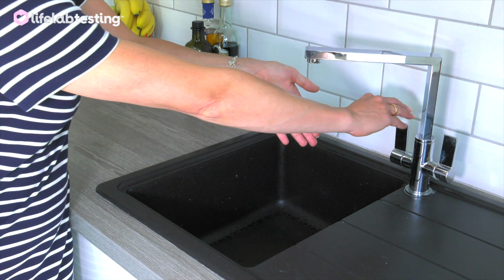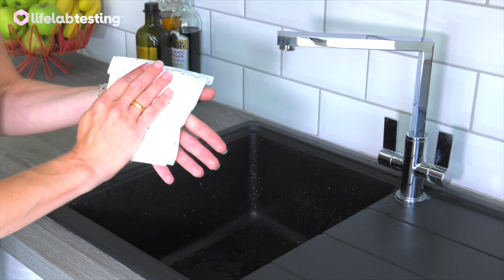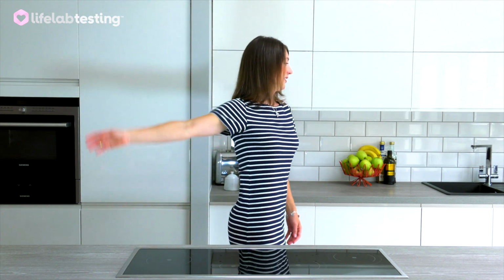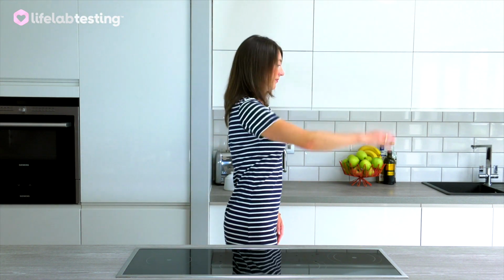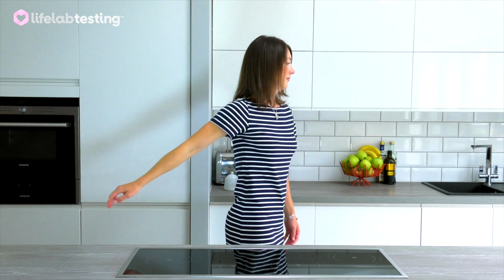Hold your hand under warm water for at least 1 minute to stimulate blood circulation, and then carefully dry your hand with a towel. Stand up and swing your arm around in a circular motion 5 to 10 times with your arm as fully extended as possible. This helps to stimulate blood circulation. Continue standing until you have finished taking your sample, if possible.